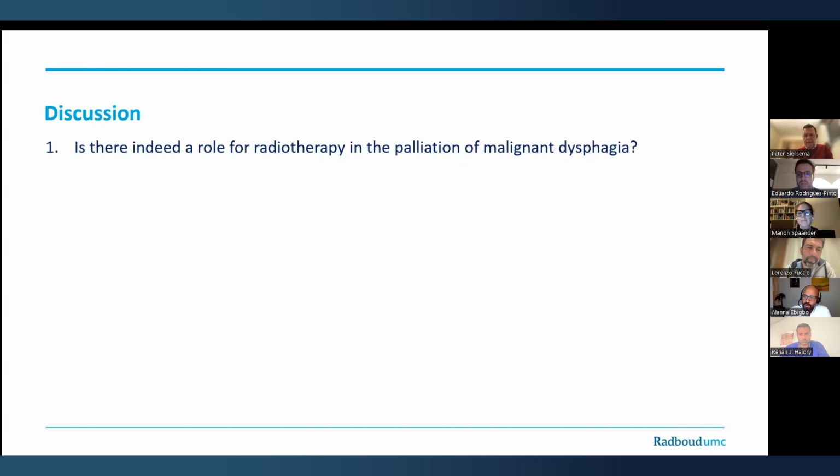Manon, may I ask a question on that? Do you think that the extent of the malignant stricture should influence, in this case, the kind of stent you use? What do you think on that? Lena, absolutely a good point, because indeed, when it is a really long tumor tract, I think that the risk of ingrowth is higher in the partially covered stent, and usually then I choose a fully covered stent. Yeah, that is a good comment. And you, what are you doing? I totally agree. Thank you.